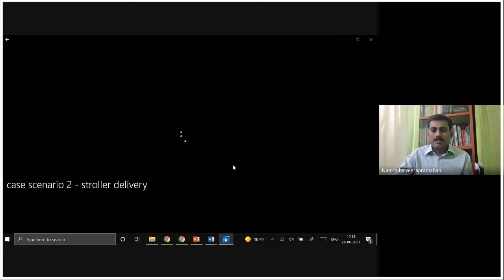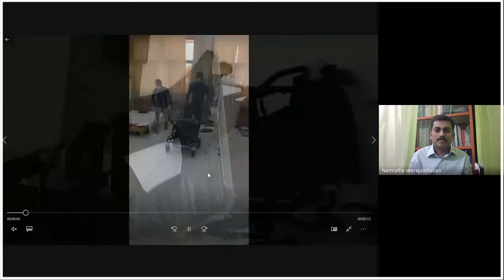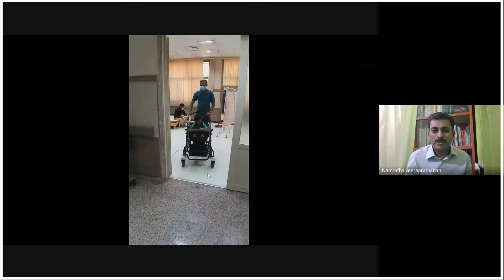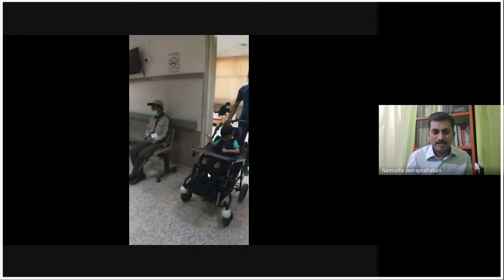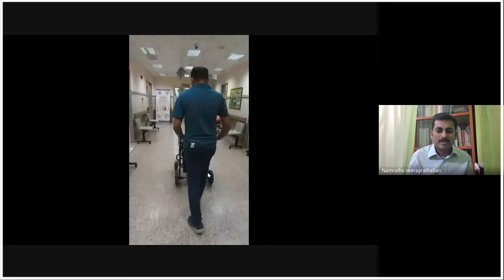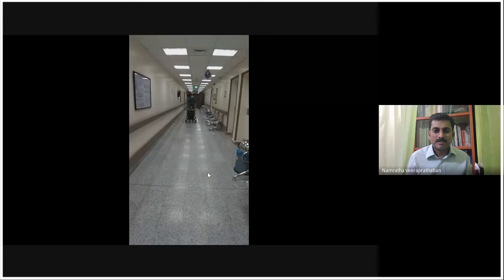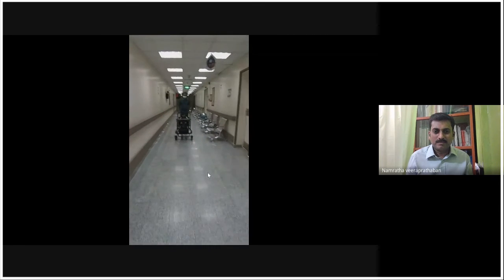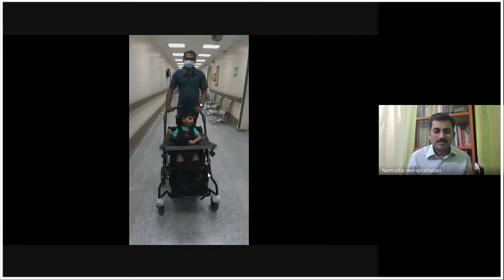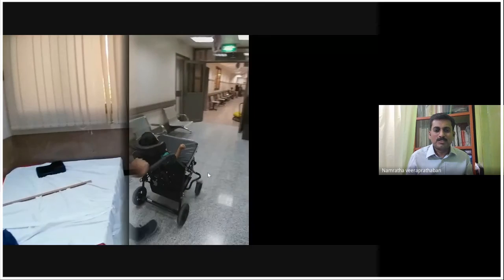Here it comes. Okay, we position the same boy in a stroller now. See, I have positioned him, and look at his posture now, and look at his interaction with the environment now. He is almost fully awake now, and I have tilted it a little bit. Look at the head control now. Look how he's going to interact with the environment, how he's going to explore his own environment. Look at his posture. Look at the accessories, the seating system and everything.